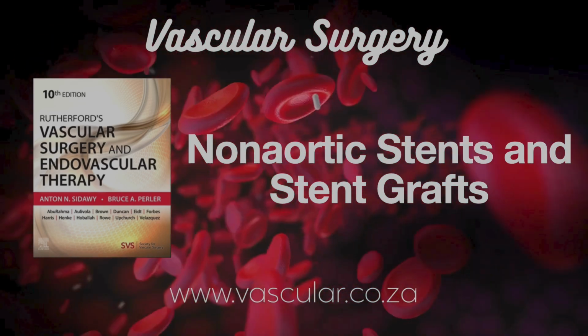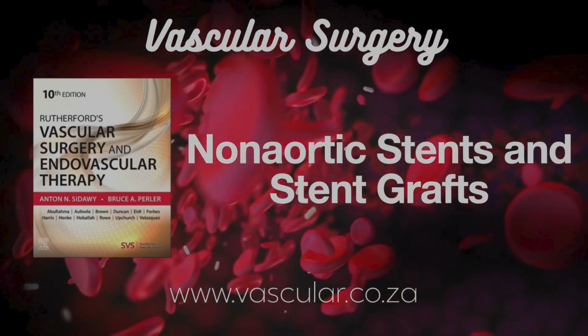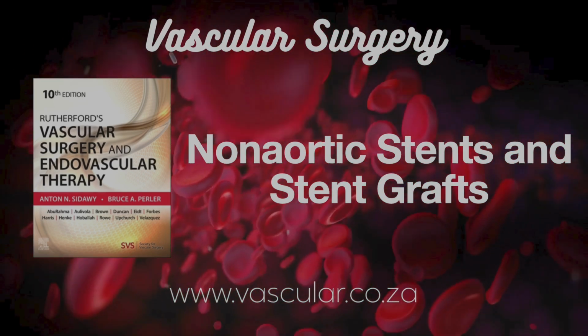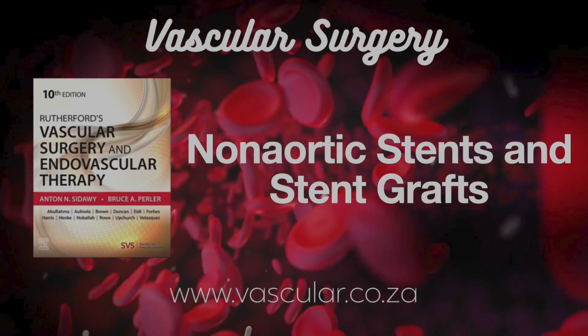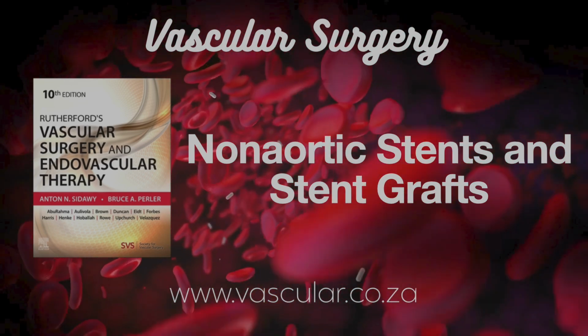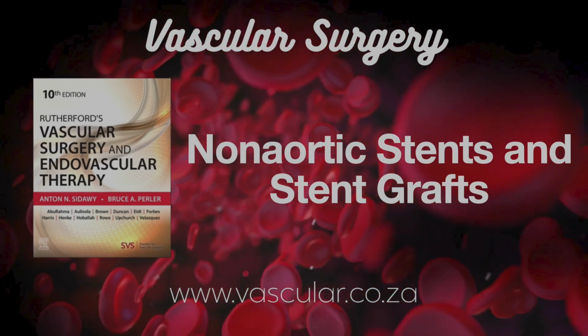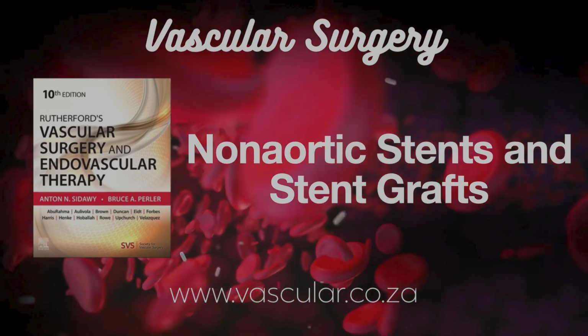Okay, moving down to the SMA and renal arteries, supplying the intestines and kidneys. Similar story for blockages right at the origin, where they branch off the aorta. Often plaque extending from the aorta, so BE stents are common for their radial strength and precision. Covered BE stents might offer extra protection against debris breaking off.